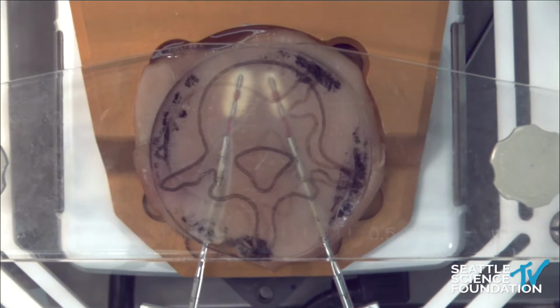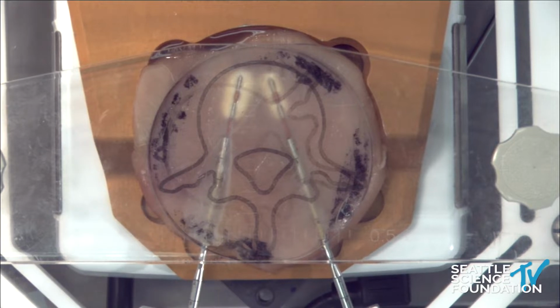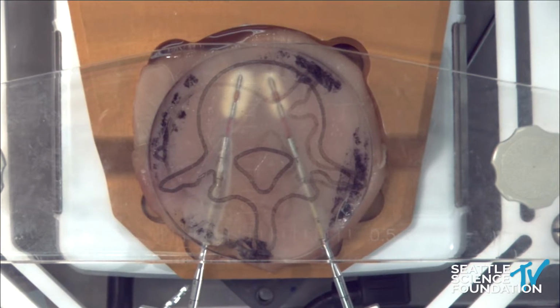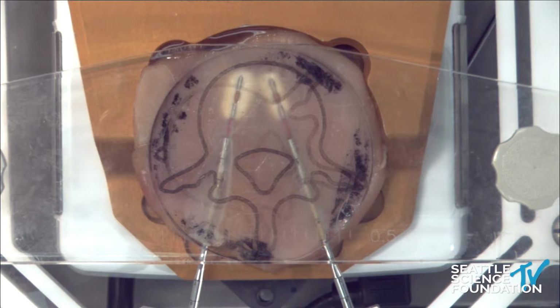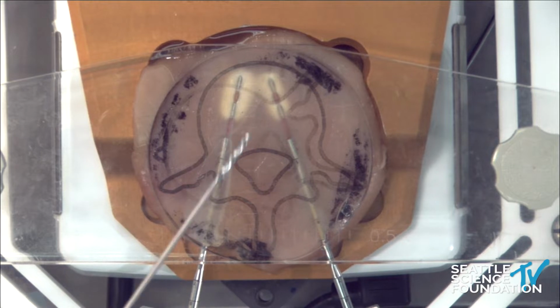We're going to take a look at, well, this is a piece of chicken here, and the OsteoCool device. What it does is distilled water is funneling through the tip of the needle so that it takes away the heat from the surface of that probe, so you're not providing char to the tissue in that area, and provides a heat sink in that area, which provides a larger ablation zone.